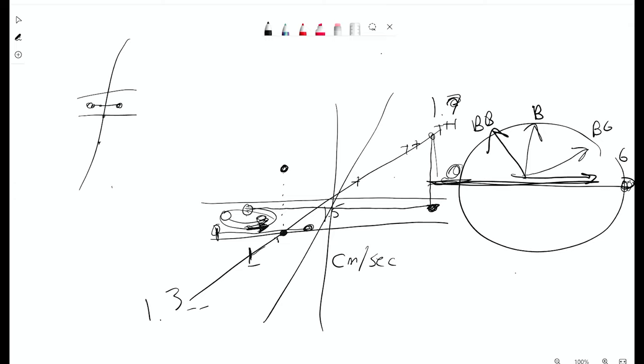Is there a way to determine the optimal Venc prior to the exam? No. Like a scout? I mean, there are values. In the heart, if I'm doing the aorta and the patient is not stenotic, then my Venc is typically going to start out at a certain value. There are Venc scouts that you can use as well, where you can say, okay, I'm going to do a 9 and a 10 and a 12, and I'm going to see which one has the brightest blood without aliasing inside of it.